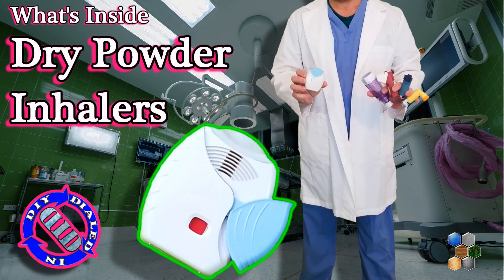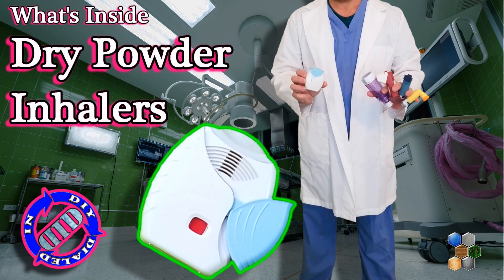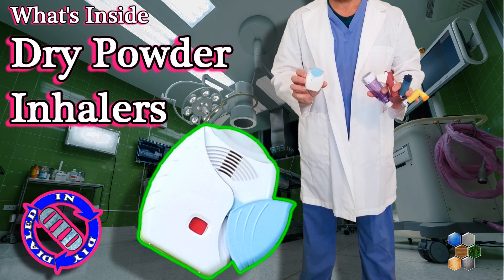Welcome back! Today on Dialed In DIY, I'm gonna take an advanced piece of medical tech and rip it apart.